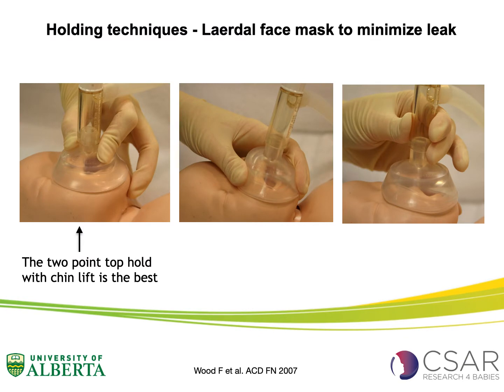What could be the reason for that? First of all, one thing we're not 100% sure about is what the best holding technique is for face masks on an infant's face. I picked these pictures from a study which is 15 years old now, and it's the latest study on optimal face mask position. This is a mannequin study where it actually showed that when you use the mask as it's held in the left picture, you have the least amount of leak.